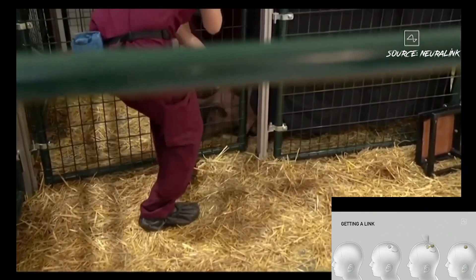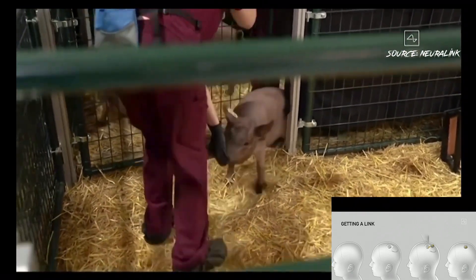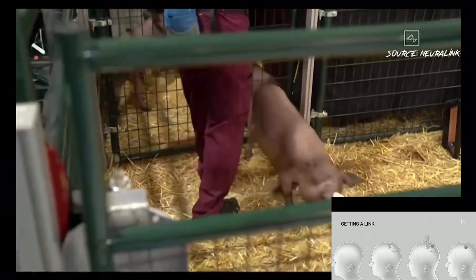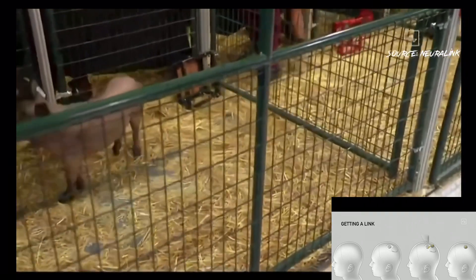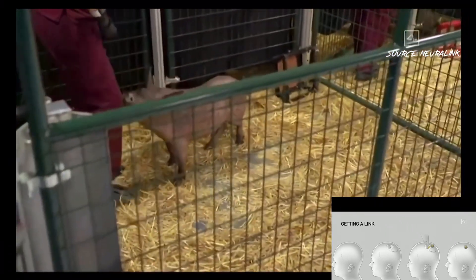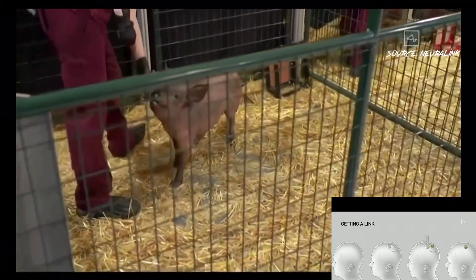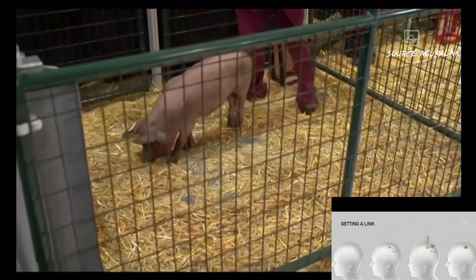We're able to show that you can actually have multiple Neuralinks implanted, and again, healthy and happy and indistinguishable from a normal pig. So it's possible to have multiple links in your head and have them all be sending out signals and working well.